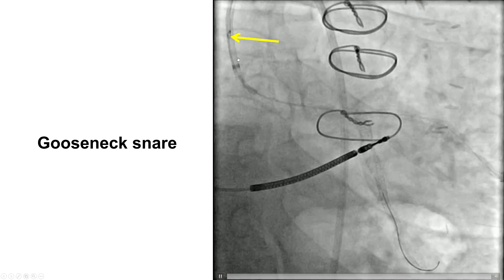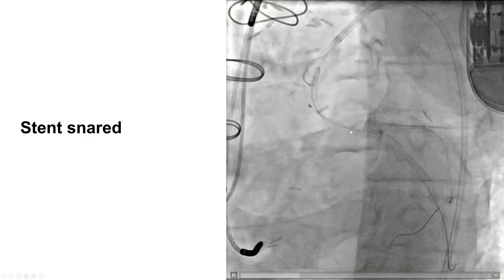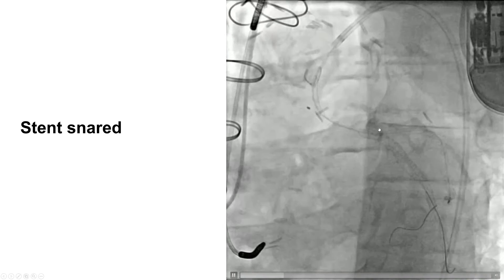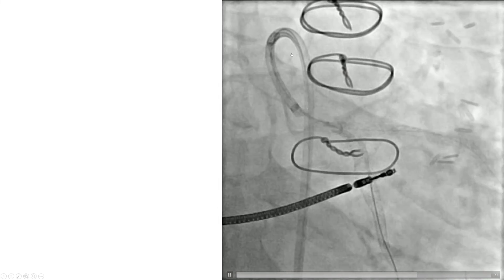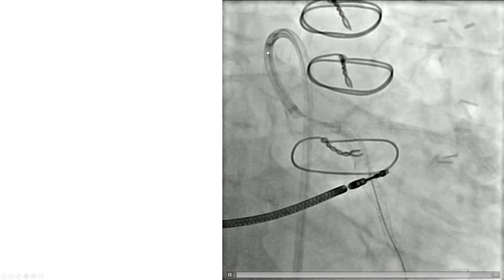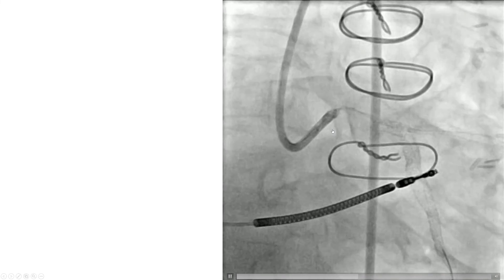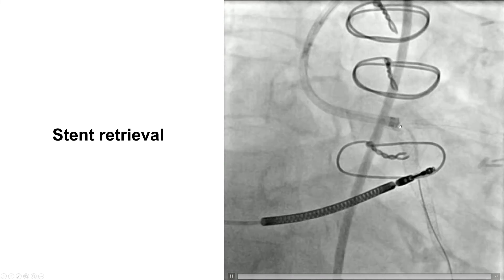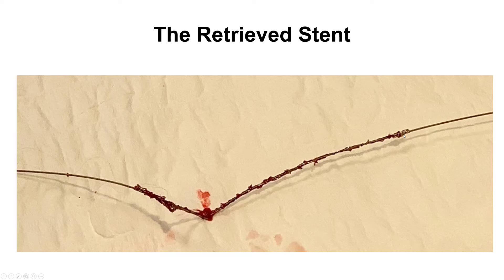We tried retrieval using a small gooseneck snare. It was hard delivering the snare down to that vessel, but eventually we were able to partially advance it over the lost stent, tighten the snare, and try to withdraw. There was a lot of resistance and deformation of the stent — it was still stuck within the previously placed stents into the left main. We had another balloon inflated inside the guide catheter to provide better support. After a lot of effort, the stent did come back, though at the cost of significant pushing, with the guide all the way to the left main bifurcation. As expected, the stent was very deformed during retrieval.